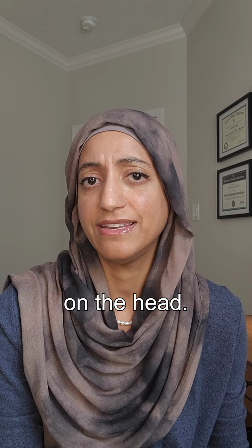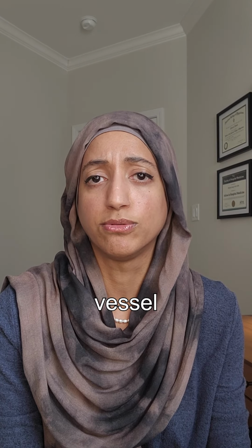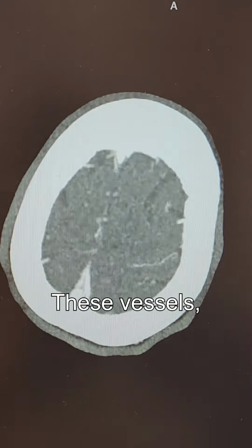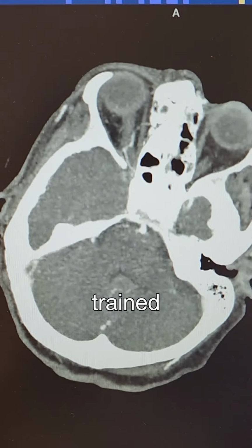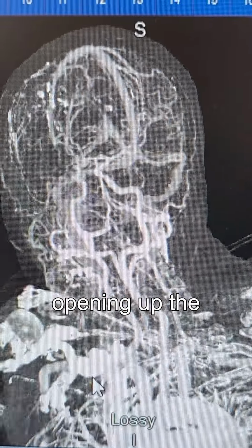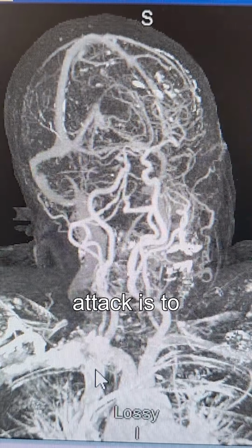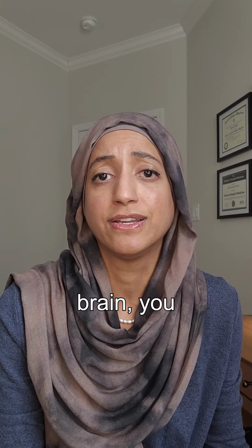There are 2 more tests that are performed in patients who have strokes on the head. There's a CTA of the head and the neck, and this is used to identify large vessel blockages in the brain. These vessels, if blocked, can actually be opened up with specialized trained physicians at stroke centers. And the idea of opening up the vessel, similar to a heart attack, is to stop any further brain tissue death, because once you lose your brain, you can't easily regain those cells and that function.